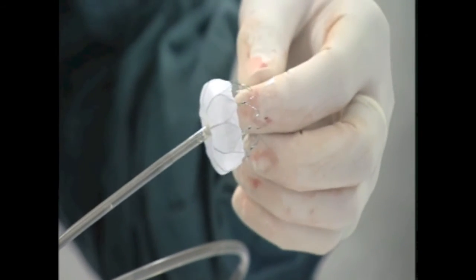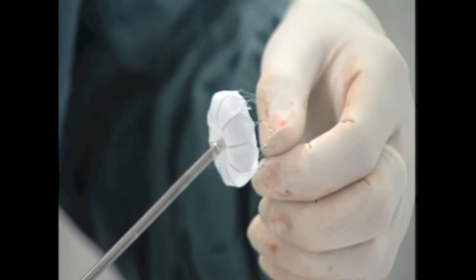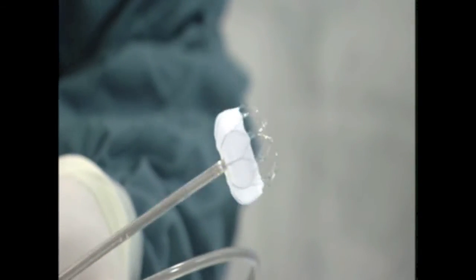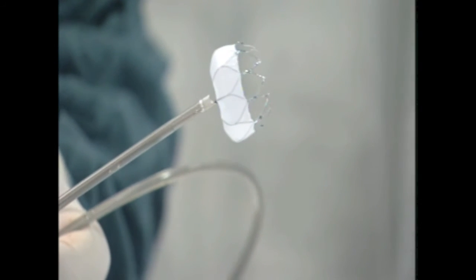In this case, I wanted to reposition it, but some of these distal struts somehow got entangled into the trabeculae, and that's why I could not reposition it. But at the end, that's a good feature in this particular case, because we have complete seal and there's additional protection against embolization. Okay, any questions or comments?